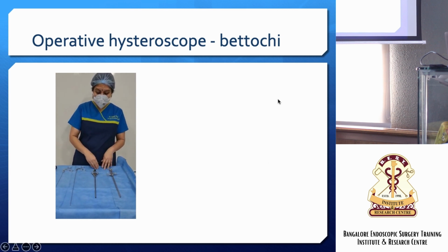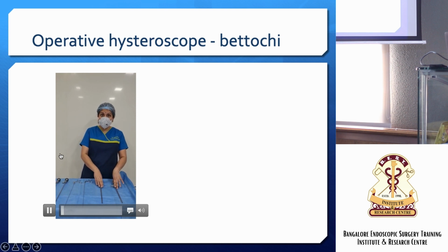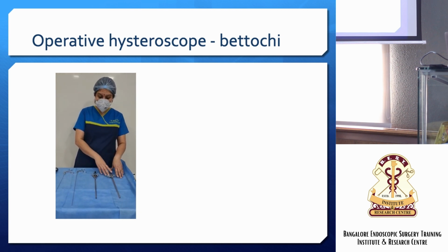Operative sheath. We have two operative sheaths over here from Storz, the Bettocchi type.